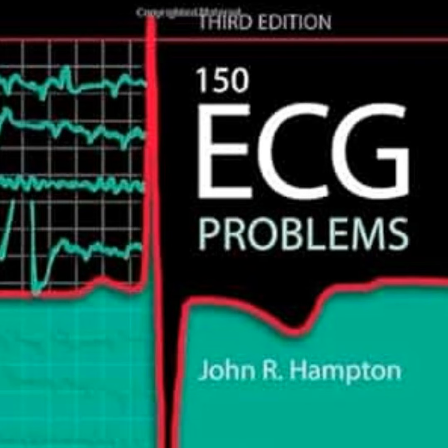So if we have a right bundle branch block and a left posterior hemiblock, two of those three highways are totally shut down. Yes. The entire depolarization of both ventricles is now relying entirely on that one single remaining left anterior fascicle. Exactly. That's crazy. It's literally like a major interstate highway where two lanes are closed for construction and all the traffic is being forced over a single super fragile detour bridge. That is a brilliant way to picture it, and it's a fragile bridge that often shares the exact same compromised blood supply as the pathways that just failed.